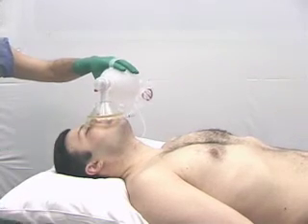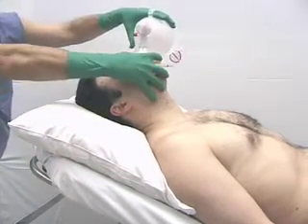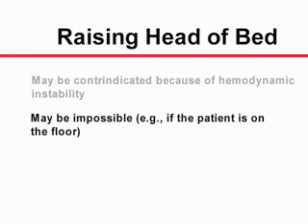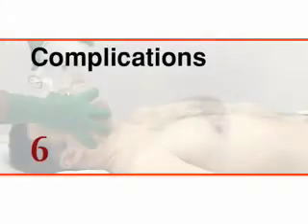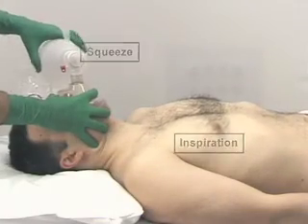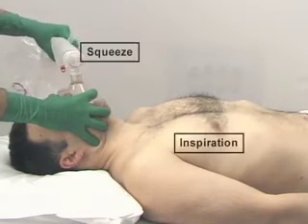Raising the head of a bed may facilitate the delivery of adequate tidal volumes, but may be contraindicated because of hemodynamic instability or may be impossible, for example, if the patient is on the floor. When the patient is breathing spontaneously, one must synchronize the delivered tidal volume with the patient's inspiration.